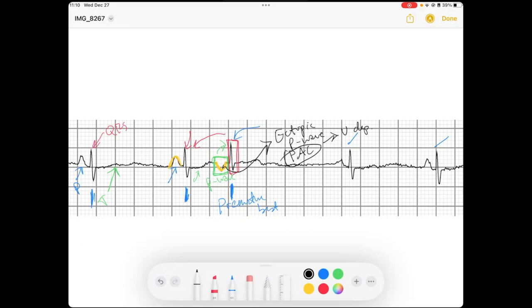So, these ectopic P waves, if they fire early, they are then termed a premature atrial contraction. And if you look at our normal beats after that, you've got these normal P waves that lead to QRSs, and then another P wave leading to QRS. So, that's very classic, how you would classically see a PAC.